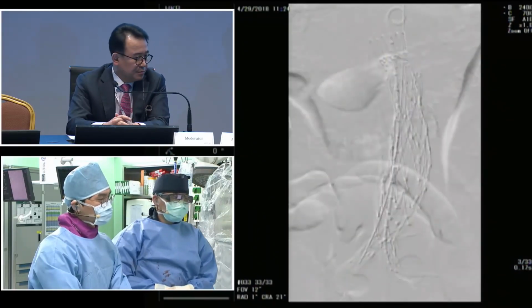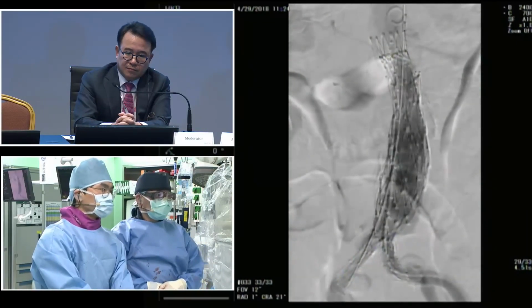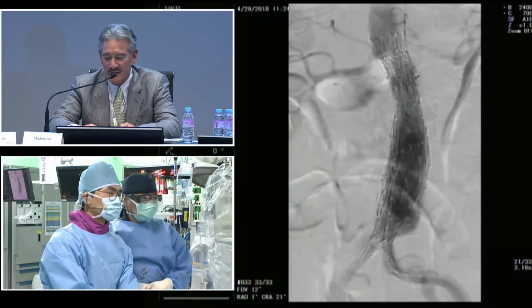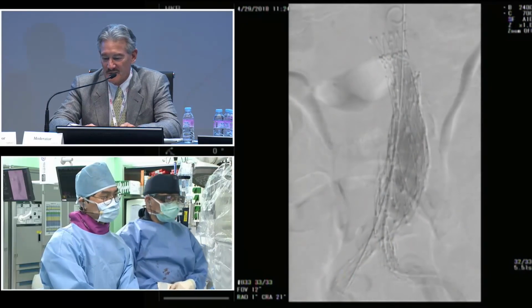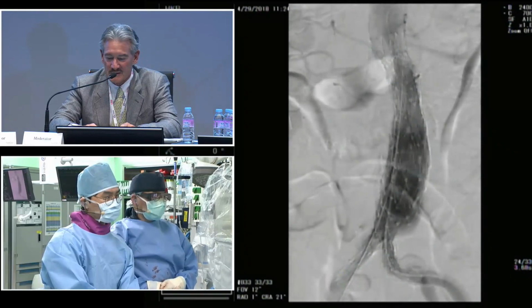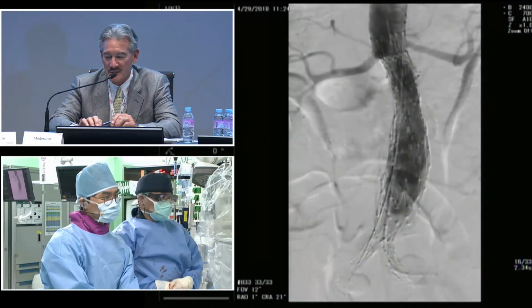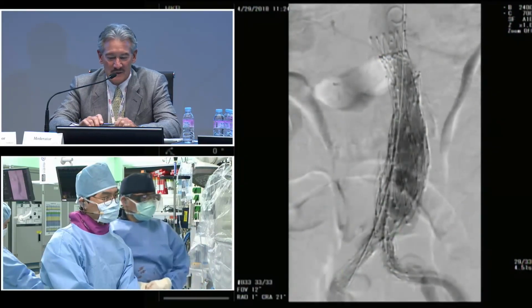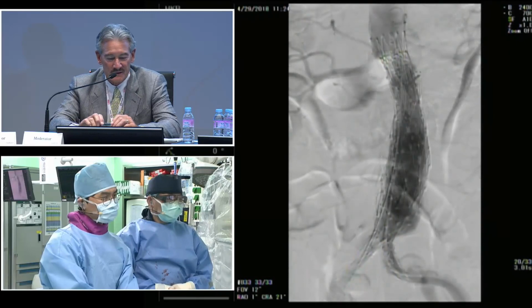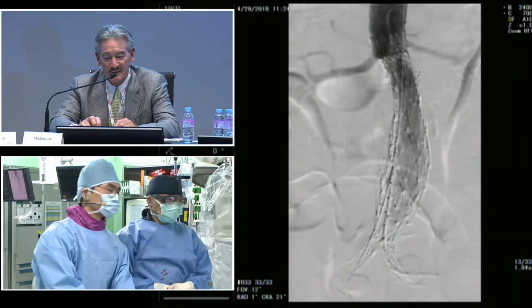It's excellent positioning. I think you have good sealing proximally. There's still contrast filling distally, just above the aortic bifurcation on the left lateral wall of the aorta, but I can't tell if that's type 2 from a patent lumbar or where it's coming from, but it's not a large amount, and it doesn't appear to be proximal type 1. So I think I would conclude here, and with reversal of anticoagulation and active sealing, it should resolve. It looks like an excellent placement, great demonstration.